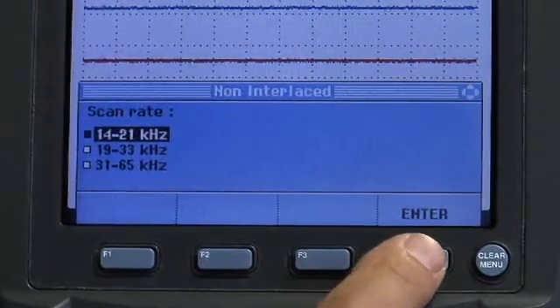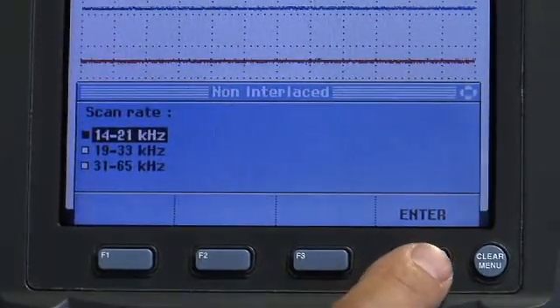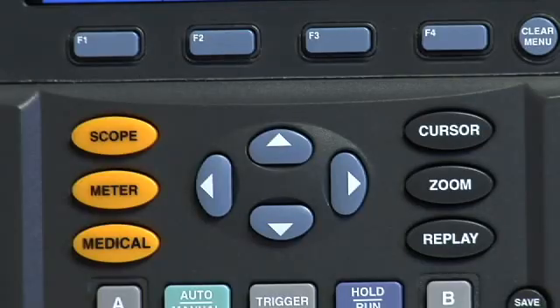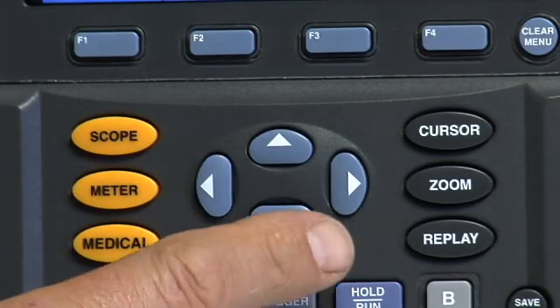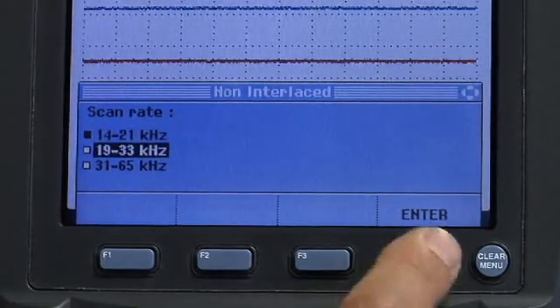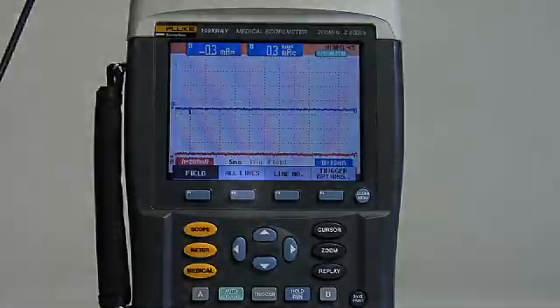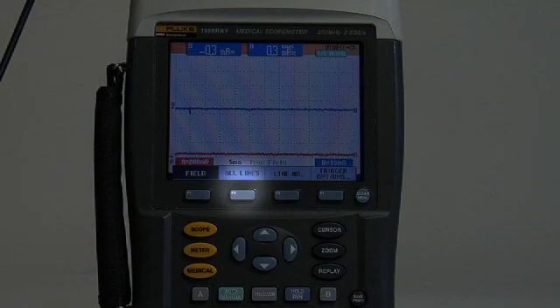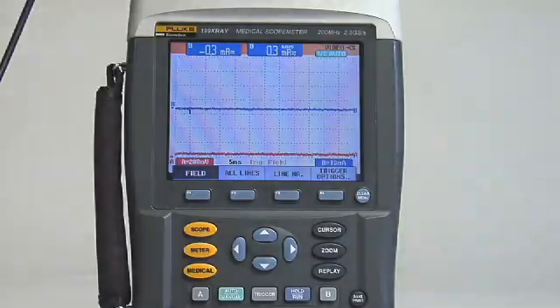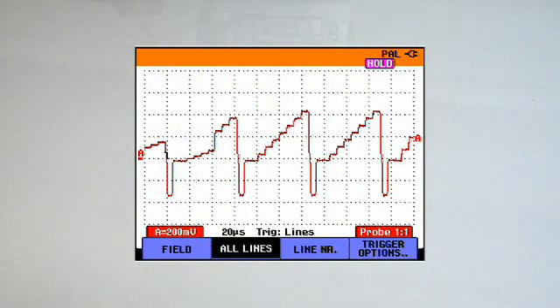Select the required scan rate, for example 19 to 33 kilohertz. At this point, selection of all lines can be chosen, or optionally one can pick a specific video line to analyze. This example is a non-interlaced scan representing all lines.